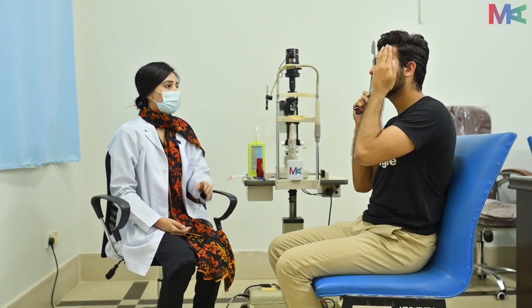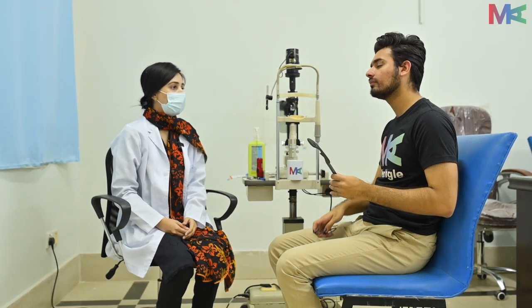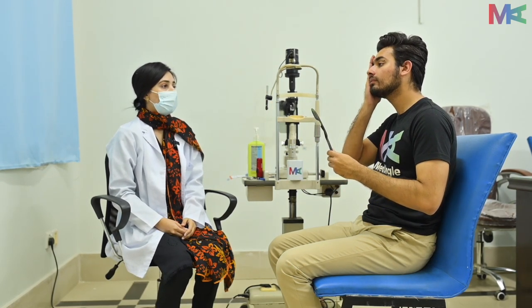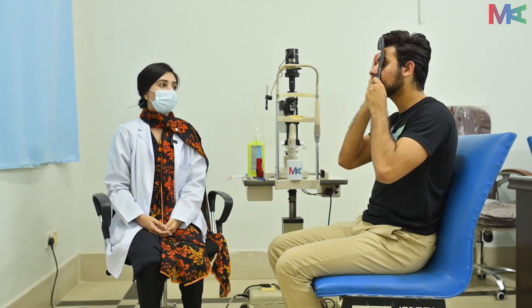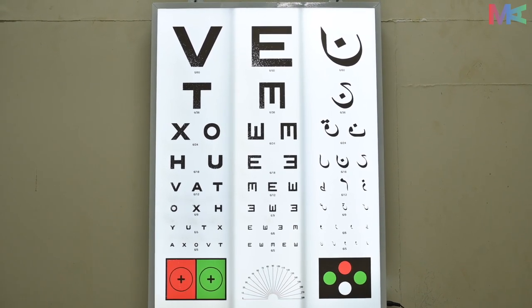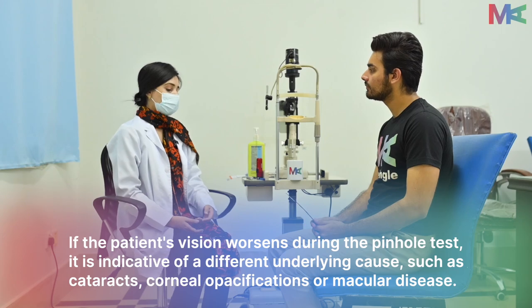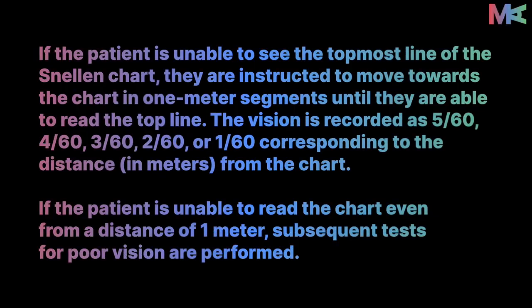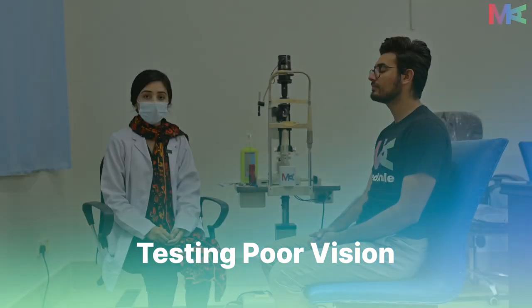Hata lein. Ab apni seedhi aank band kar lein — haat se. And through this pinhole, read the smallest letter possible from your left eye. V-T-X-O, V-T-X-O-H-U-V-A. Is less than 6/60.